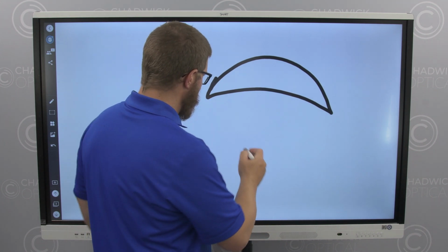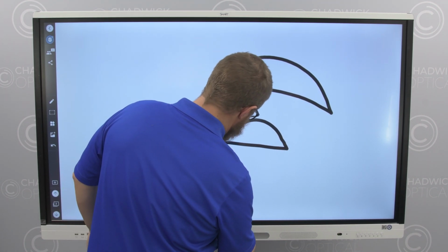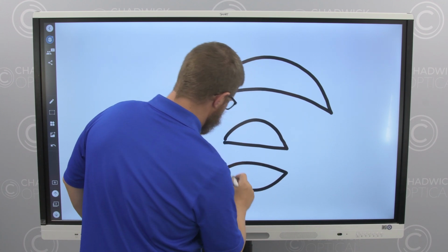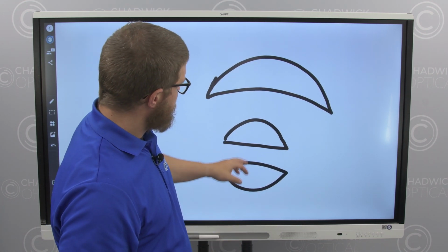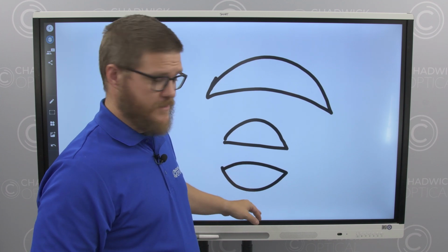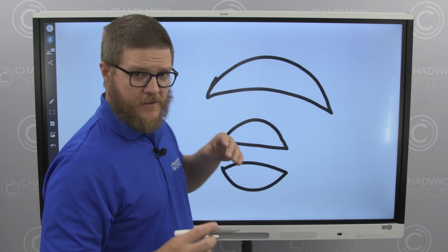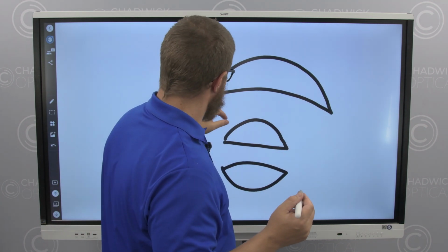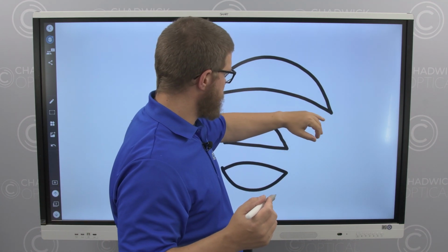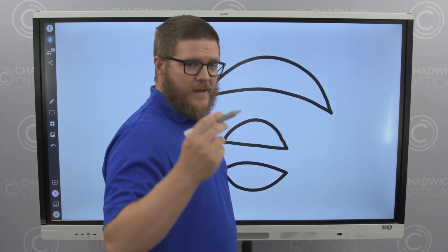Because if we do it flat or convex even, while you can potentially make a lens thinner, you introduce the opportunity for more of the oblique astigmatism. So if we do a lens with a slight concave and a freeform aspheric design, you can really optimize the shape to minimize oblique astigmatism.